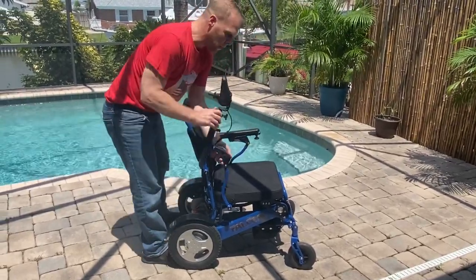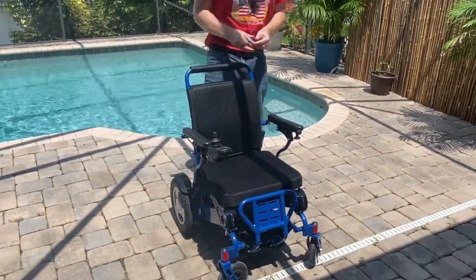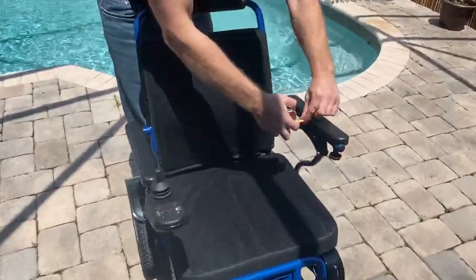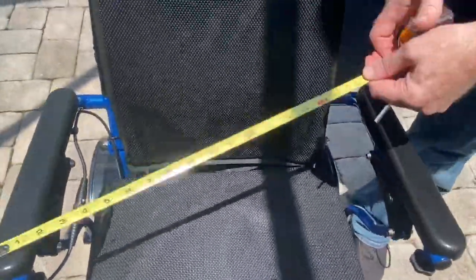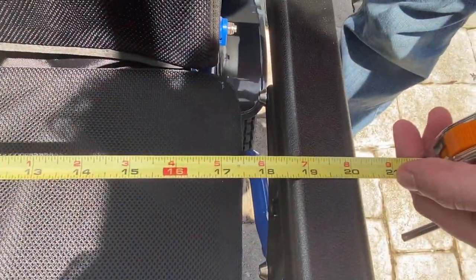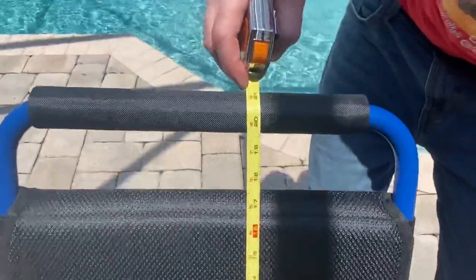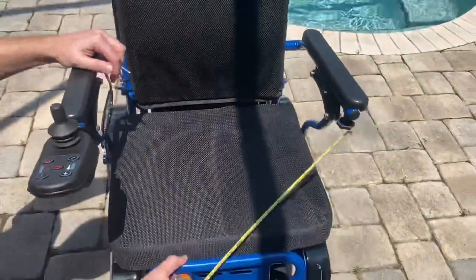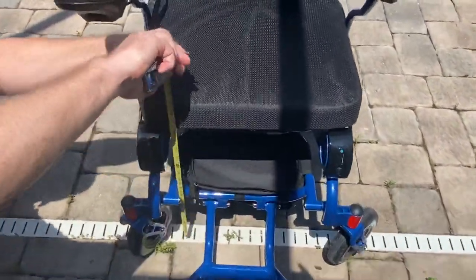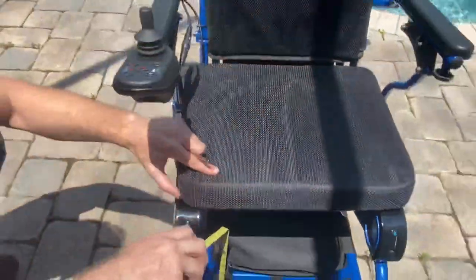Let's drop the arms down and take some basic measurements. Looking at the space between the armrests, we have about 18 to 19 inches. From the top of the seat to the top of the chair back, we have about 20 inches. The seat depth is about 16 and a half inches. The seat height from the ground is approximately 20 inches — just under 20 inches from the top of the seat to the floor.